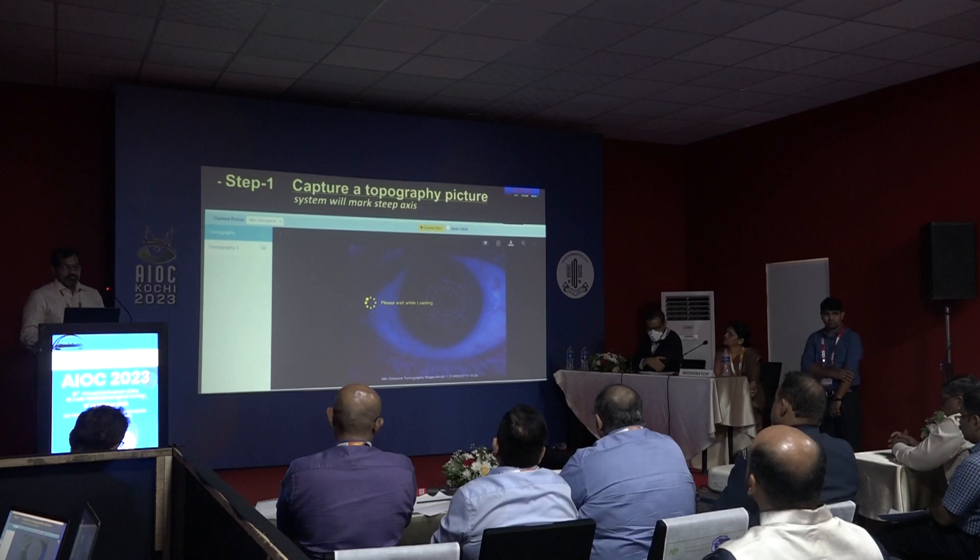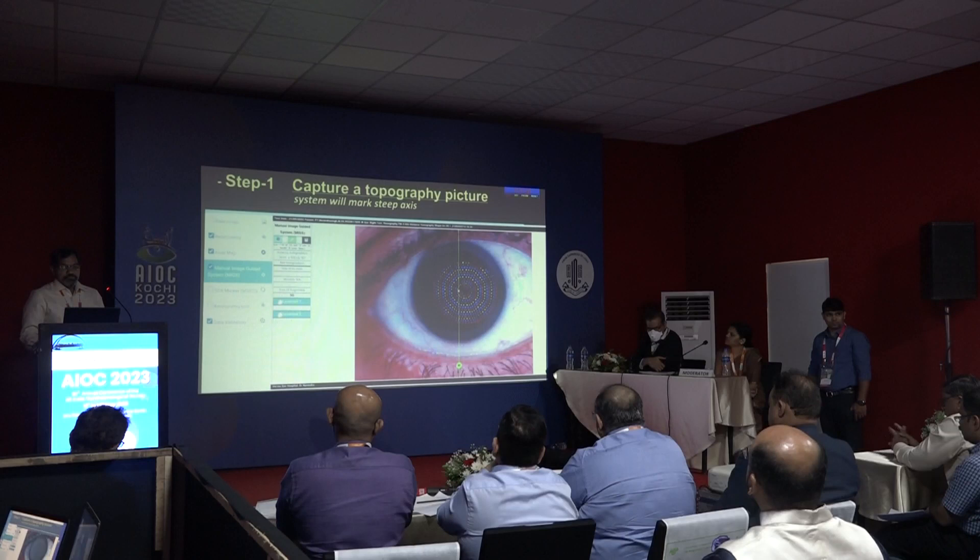Demonstration. Step 1: Marking of steep axis. Capture a topography picture. The system has automatically marked the steep axis on this topography picture.